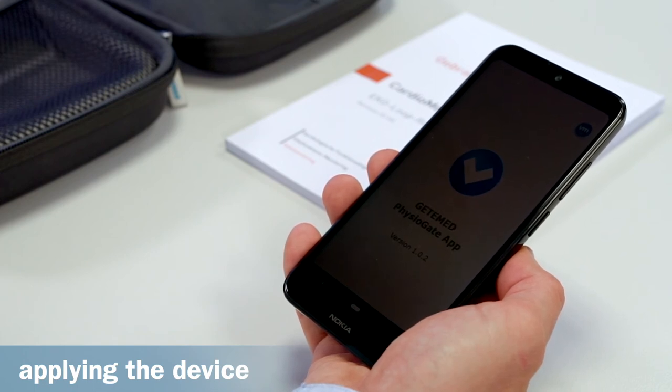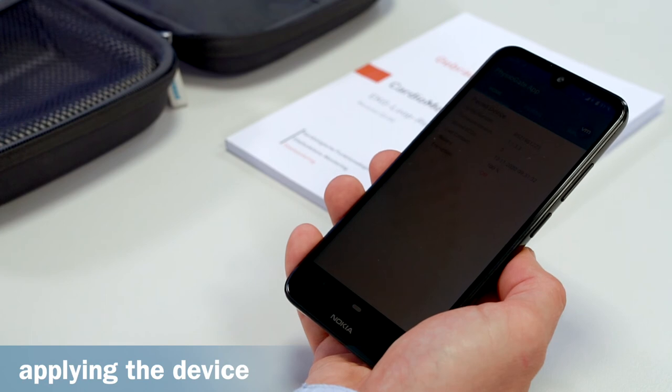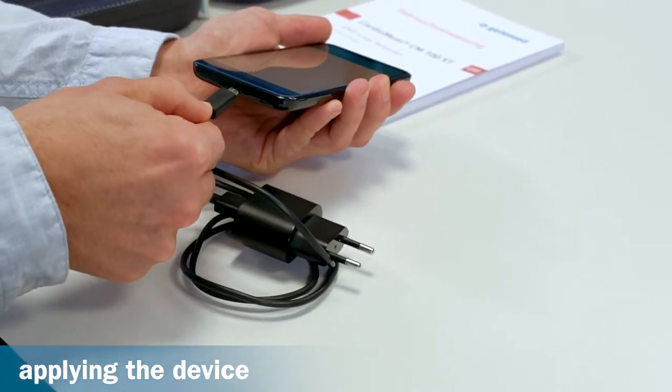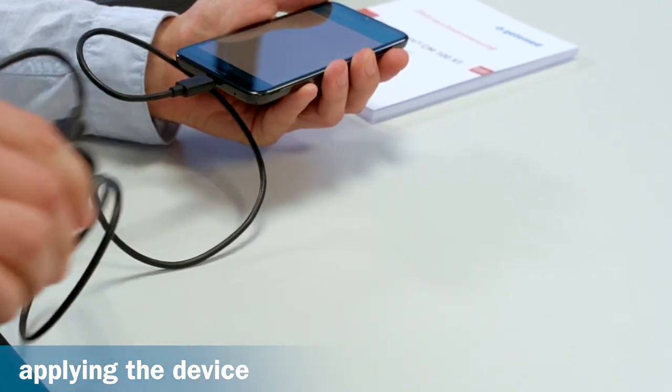The recorder and smartphone are already paired with each other upon delivery and only need to be switched on. Keep it switched on so that it can receive data from the recorder. Store it in a safe, dry place near you, and charge it once a day using the charger cable provided.